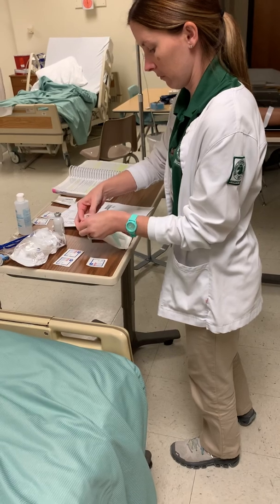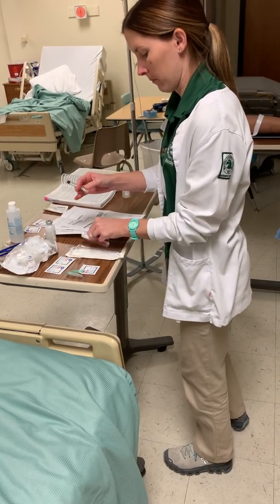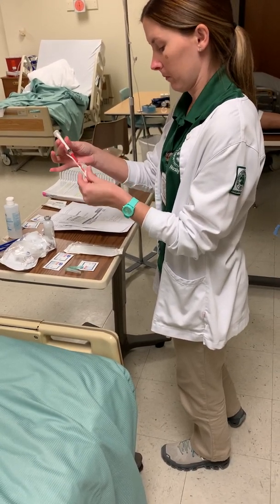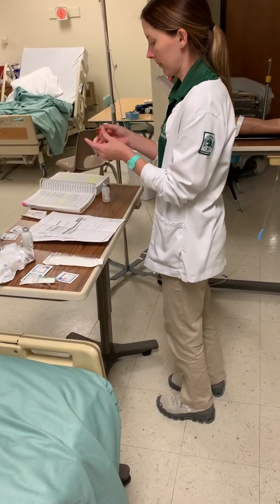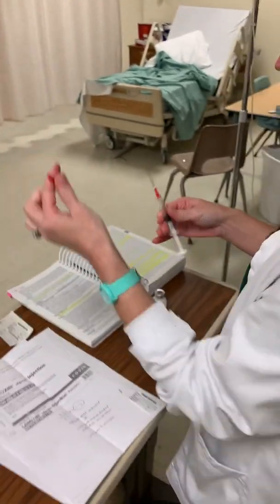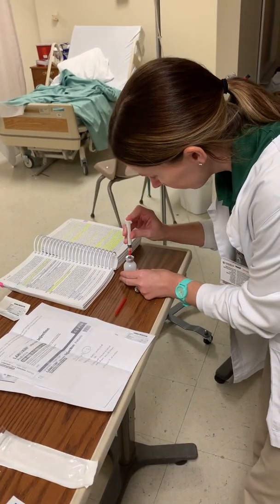Syringe. I'm going to take this needle off because I want to draw this up with a blunt tip needle. Right. The first thing I'm going to do is pull back 2 mLs. And I'm going to inject my 2 mLs of air, no medication.